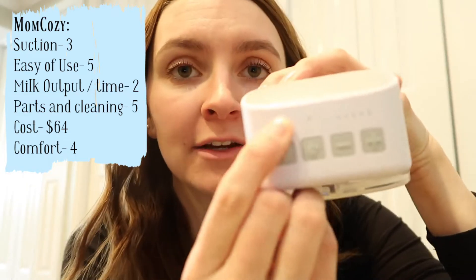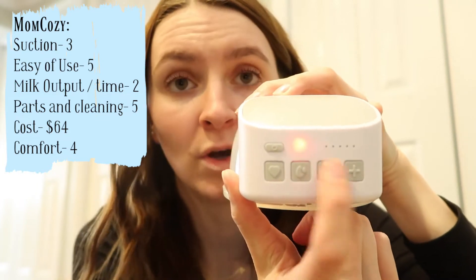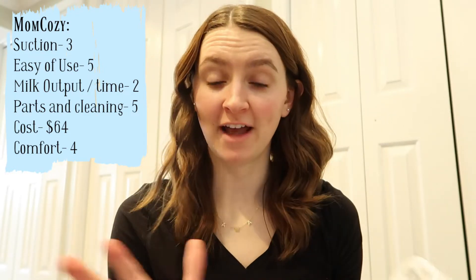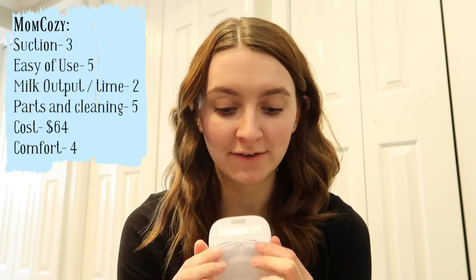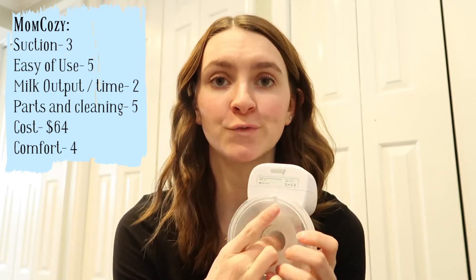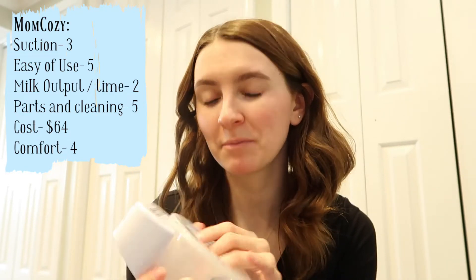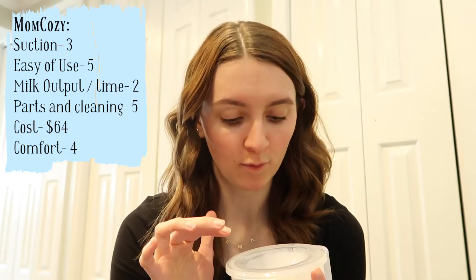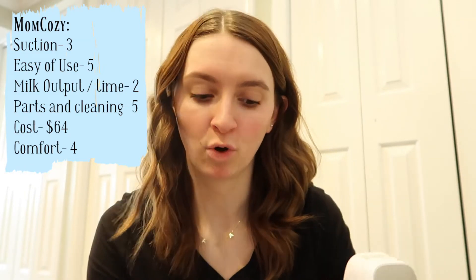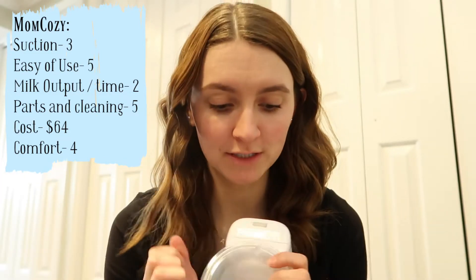Ease of use is a five — super easy. All your buttons are at the top, it tells you what setting you're on, there's one all the way up to five, and two different modes. For milk output and time I'm giving it a two. The flange is too large for most people — it says 24 but when I measured it, it was closer to a 27. A smaller flange gives more localized suction, like when your baby feeds.